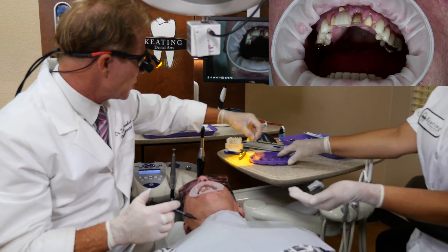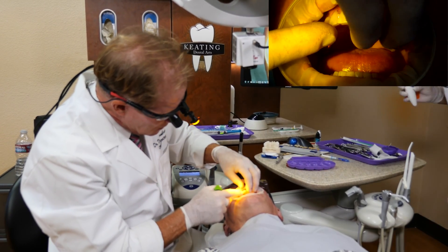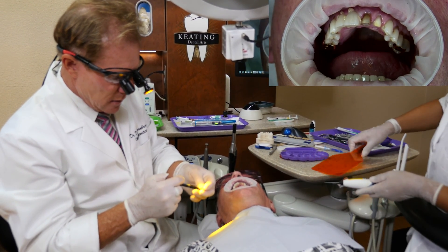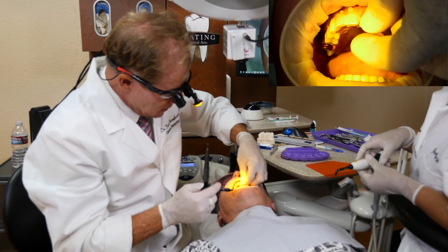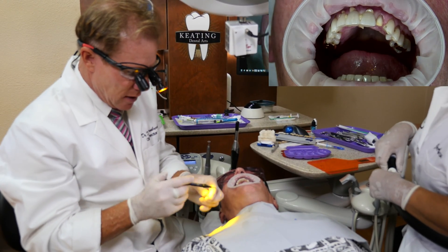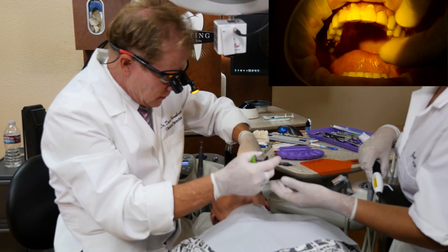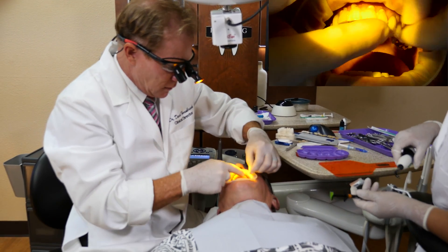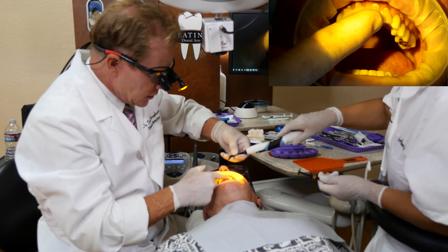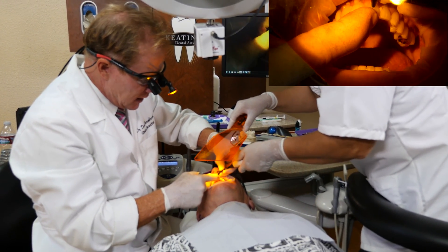Next will be the 2mm light guide. We're going to use the tack and wave technique. I cure dead center for one second — just a one-second tack. You don't turn it on until I tell you to, and you don't take it out of the mouth until it's turned off. The crowns fit unbelievably well.